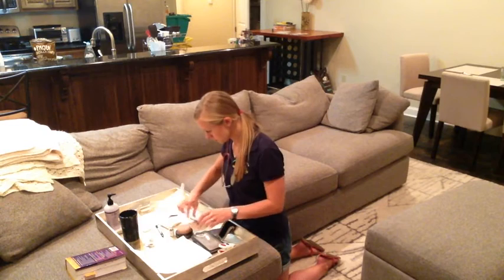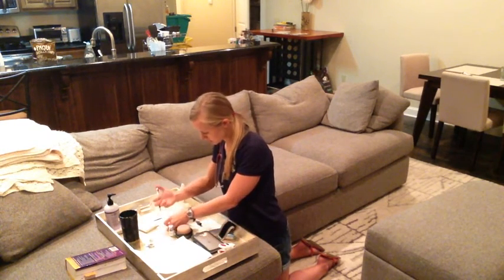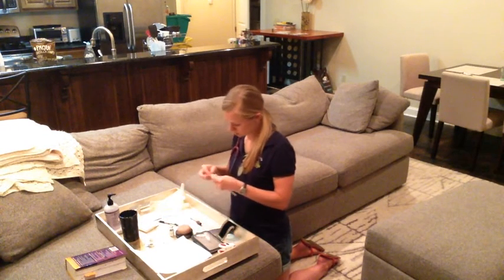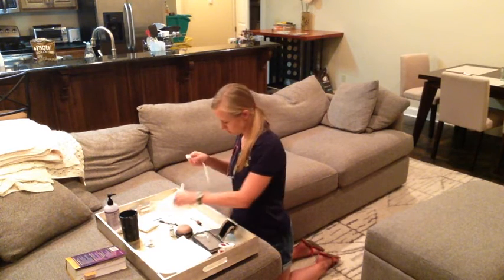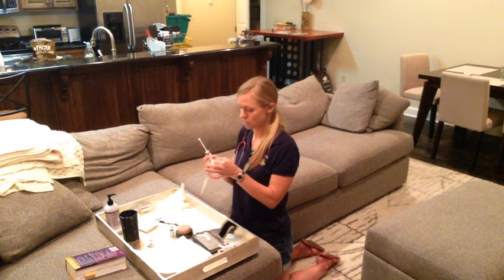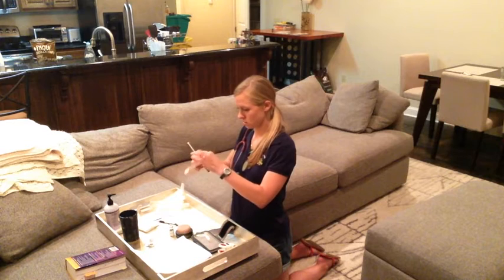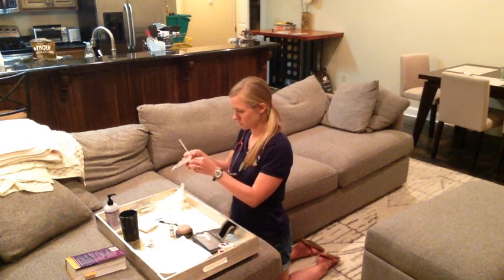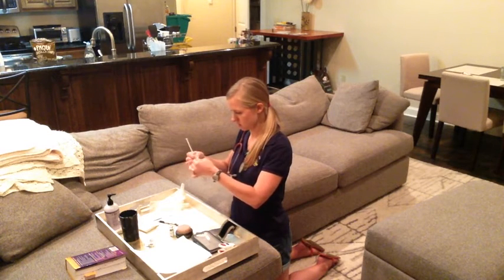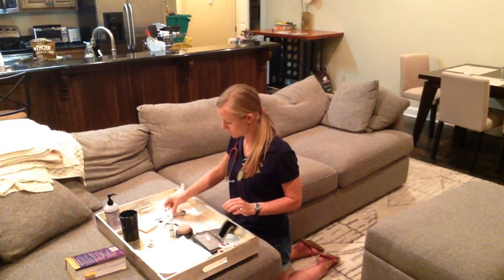We're going to label this medication. I have my label here. I'm going to write what it is and the dose. And we're only doing one patient at a time, so there should be no other patient name that you would need to put down on here. Okay, so this is our label. Ready to go. And then we're going to do our last check.